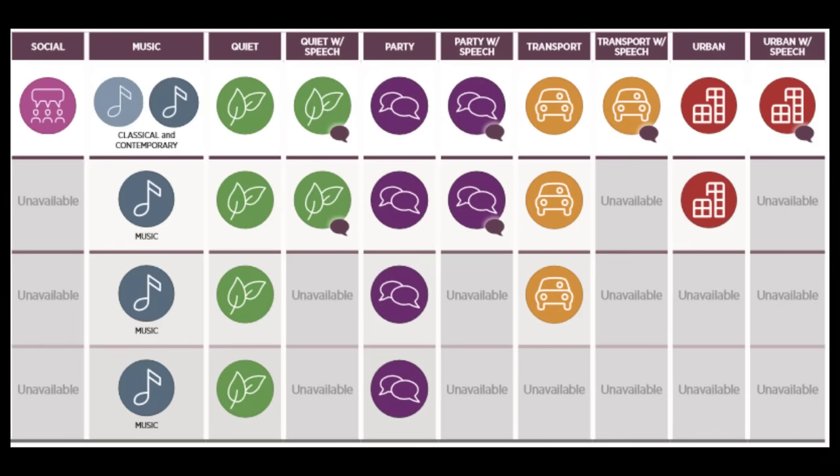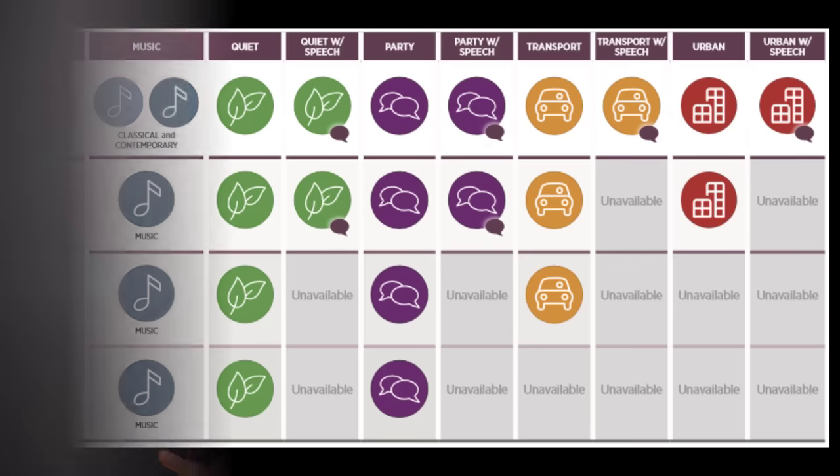This Pure Sound program that I'm talking about really acts like a universal program, meaning it still shifts you between different sound classes. So when you go into a different environment, the hearing aids identify that environment and put you into program settings that are ideal in that particular environment. And this is really nice because it lets you be a little bit more hands-free with your hearing aids and you just kind of let them take the driver's wheel.